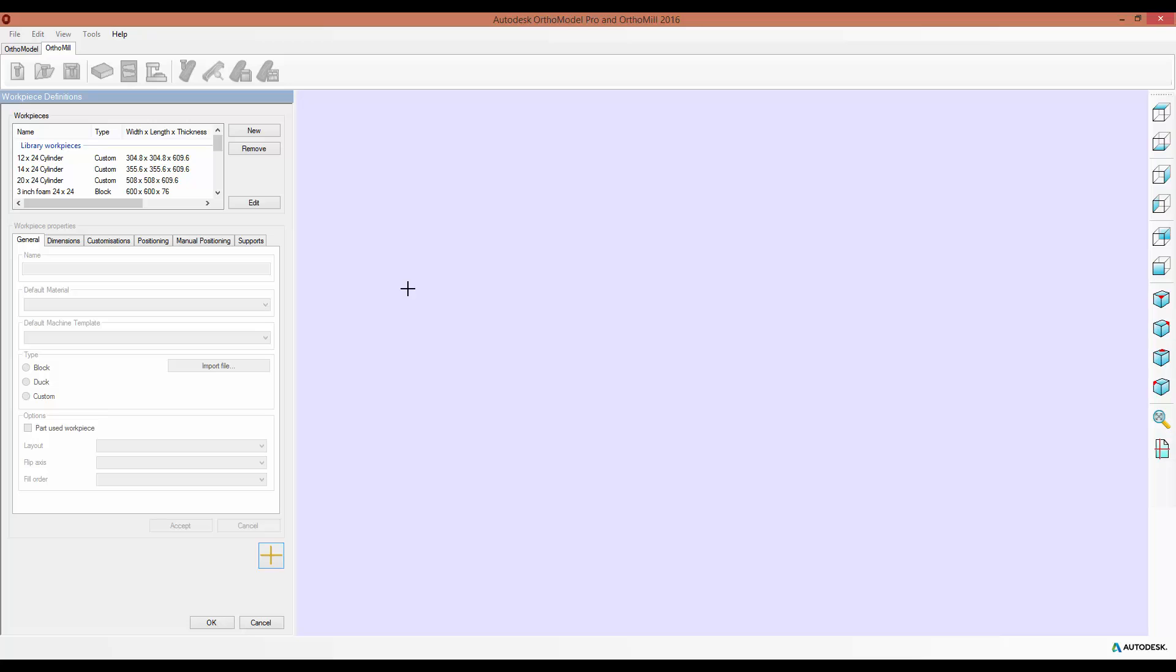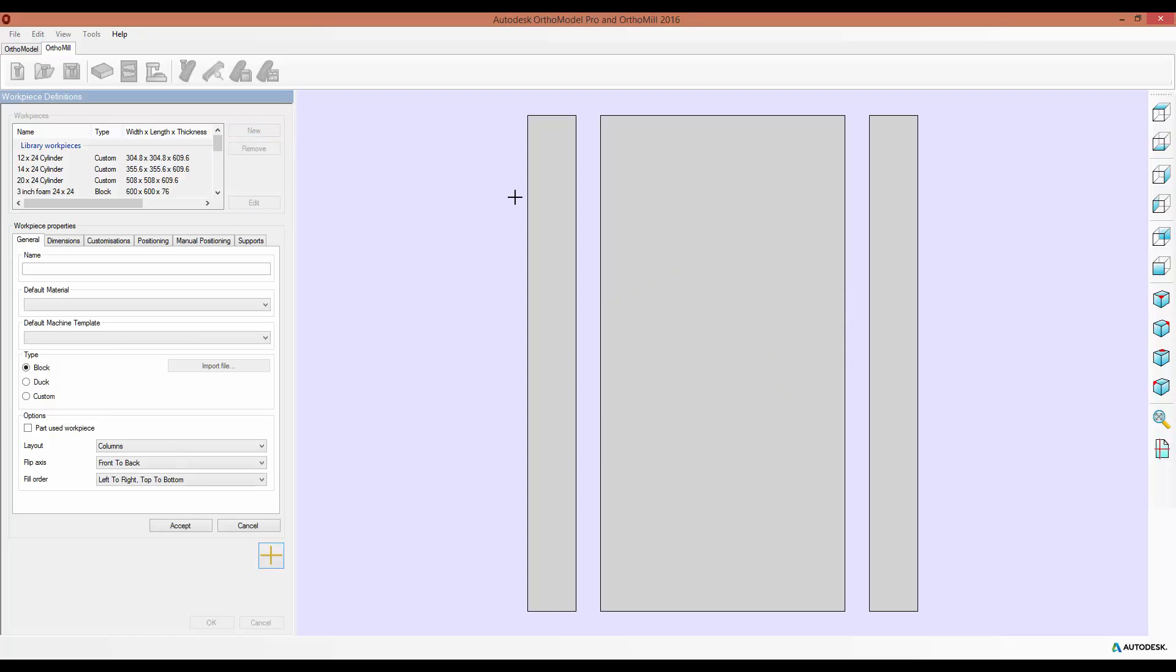And you may notice immediately these three new tabs. I've got Positioning, Manual Positioning, and Supports, and I'll go through each one of these in turn. These are available when either editing an existing workpiece or when creating a new one, which I'll do now.